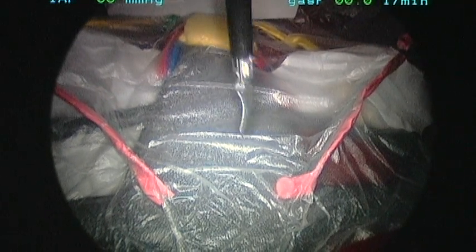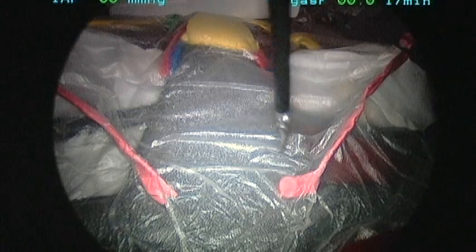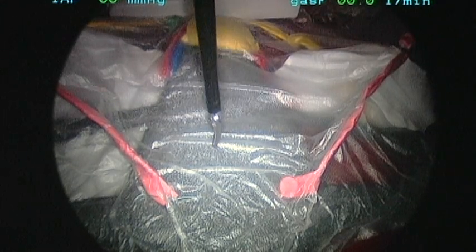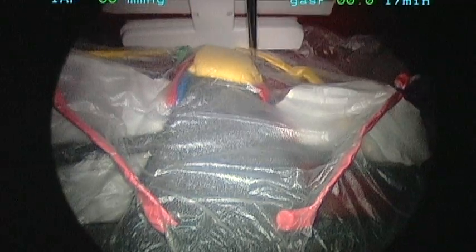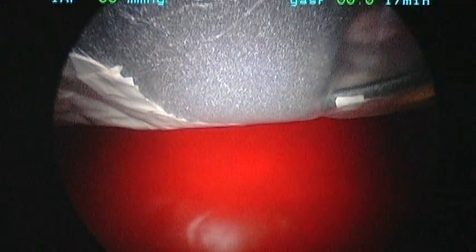So Bonnie, this is our simulated uterus. The gray in the middle is the uterus. The plastic sheath over it is supposed to simulate serosa or peritoneum. The pink ligaments on the side are round ligaments. Down here you can see the bladder, and I've simulated a uterine artery and vein. We've also simulated that there's a ureter back there, so we're going to be careful when we come near the uterine artery.